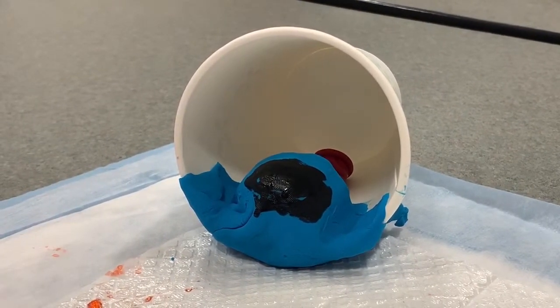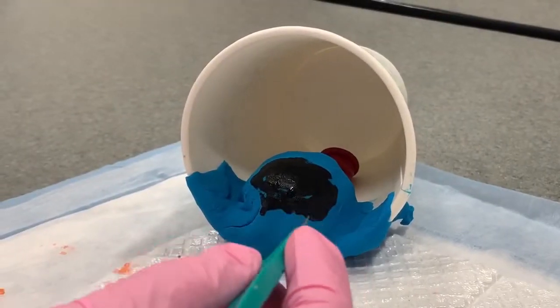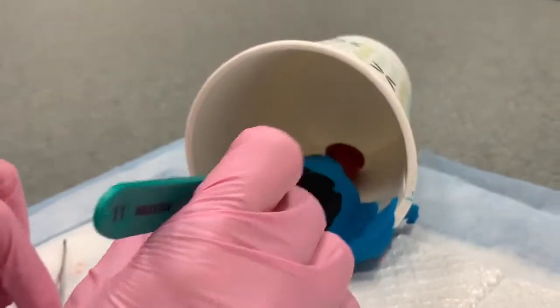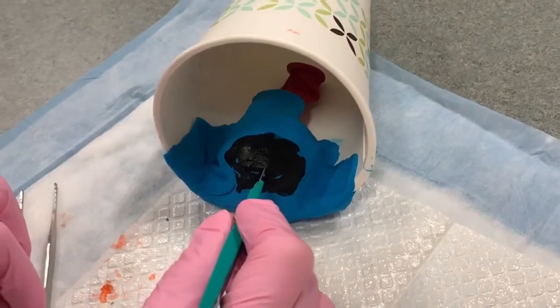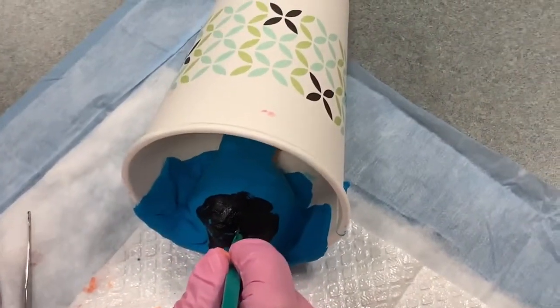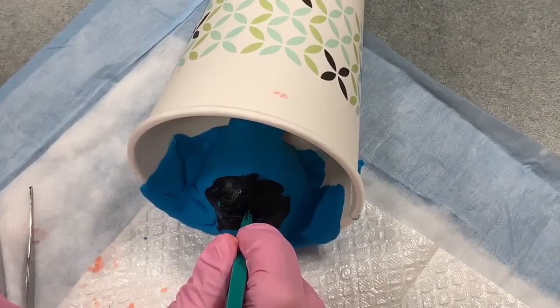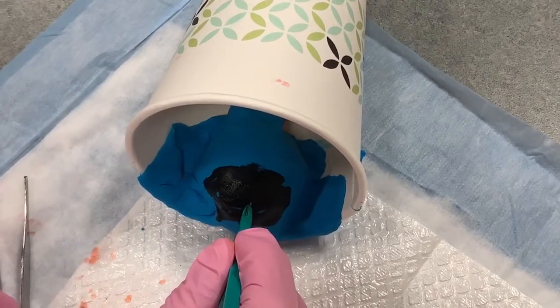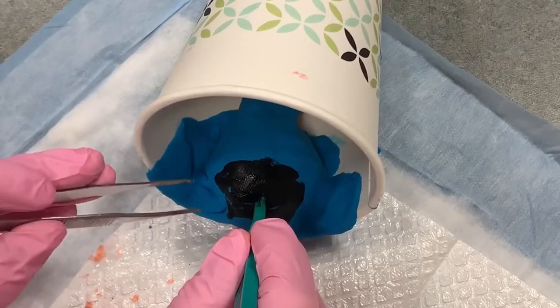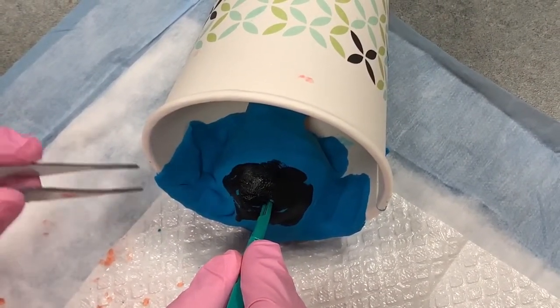Now I am going to make an incision where I applied the anesthesia using a number 11 blade. The incision is going to be 5 millimeters to 1 centimeter long. This is different from an incision and drainage, which will require an incision that is 1 to 2 centimeters long. You don't want the incision to be too big, or else the Word catheter will fall out.